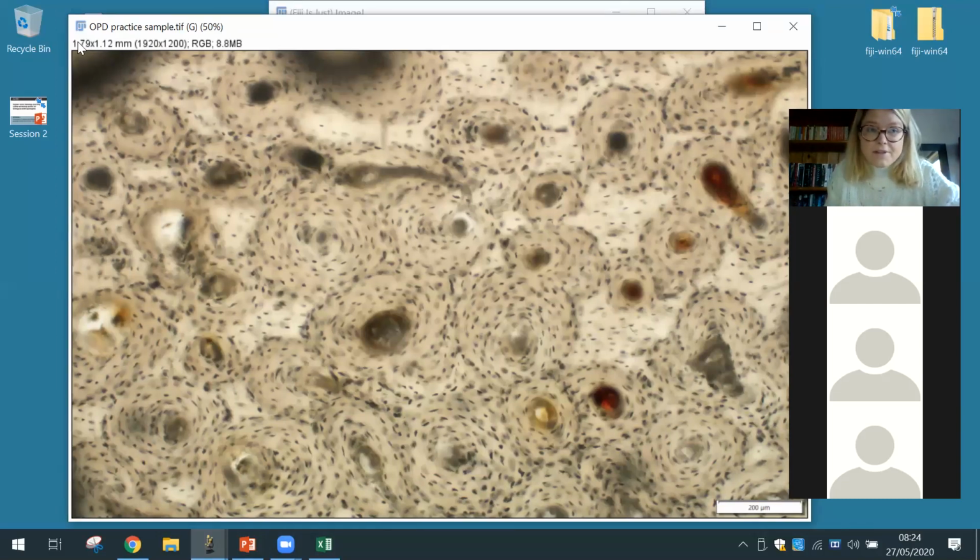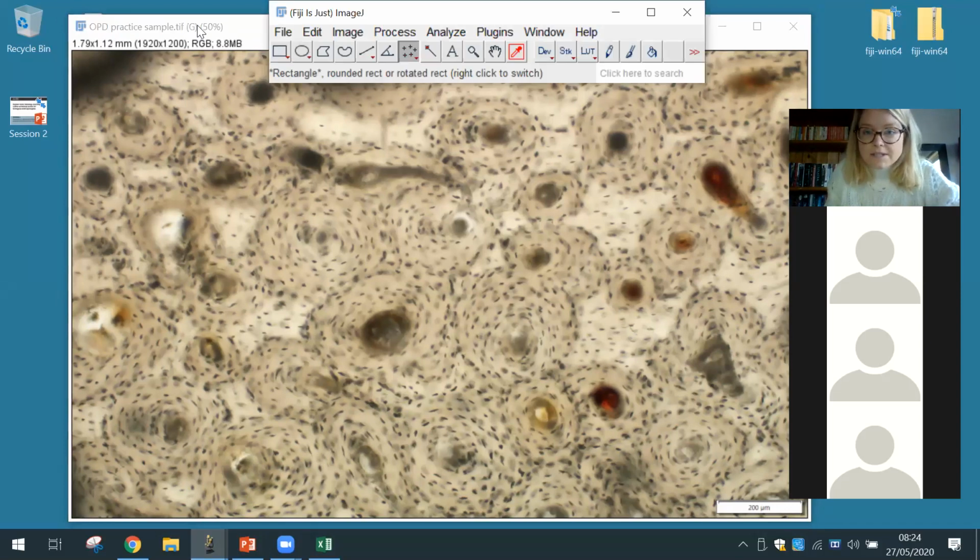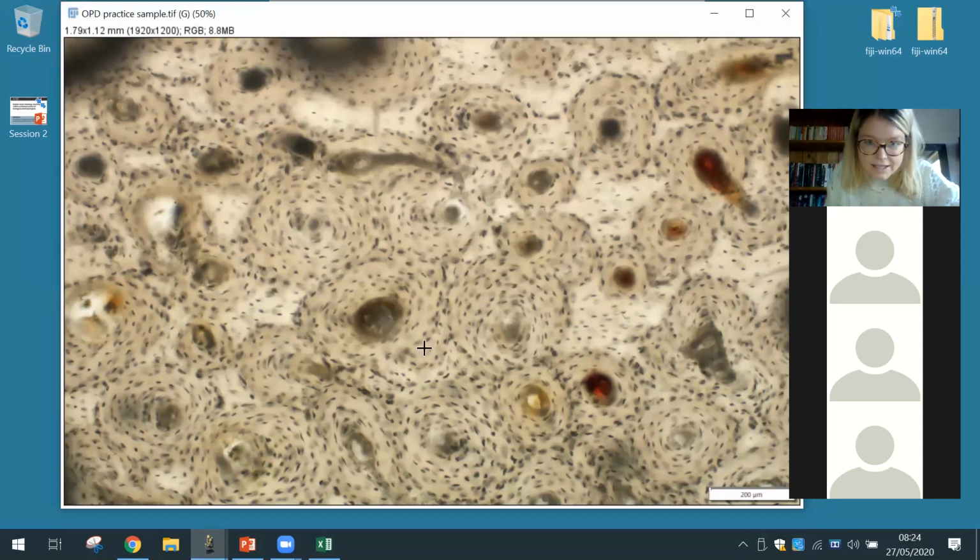Okay, so we know that the area is almost the same. I'm just going to click on these. I don't know if you're practicing right now, but if you are, good luck. This one you can tell straight away is not as remodeled. They look like they're just very tightly packed. I think this one's going over that one. This one looks like it's remodeling. This one's quite small.